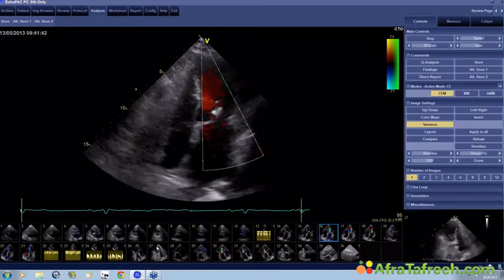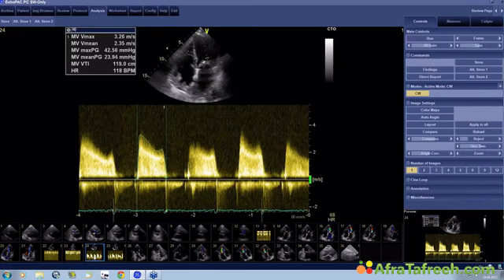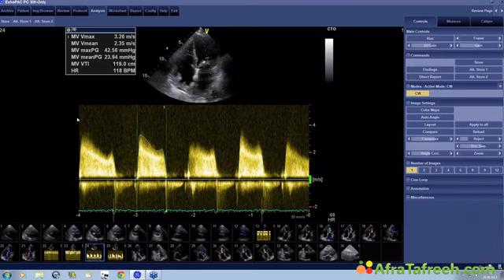The next thing we have to take a look at is what are the gradients. And remember, the patient is symptomatic, and this would make us believe that stenosis should be severe, especially if we think that mitral stenosis is really her problem. And to calculate the gradients, obviously you just trace the Doppler spectrum across the mitral valve, and then you get a gradient, in this case, of 23 or 24 millimeters mercury, a mean gradient, and a maximum velocity of 3.3 almost.